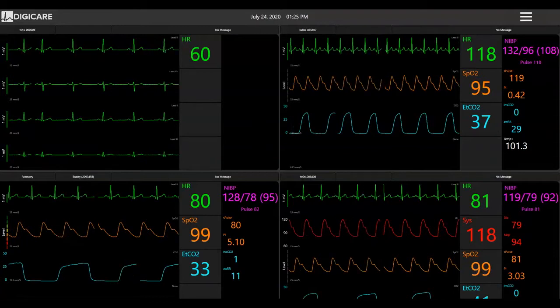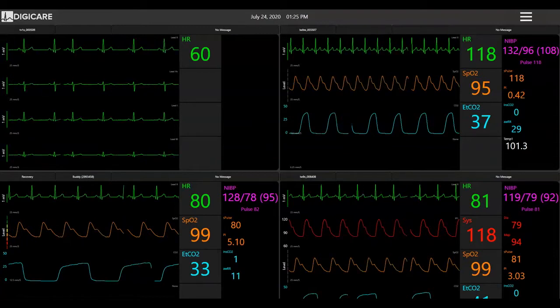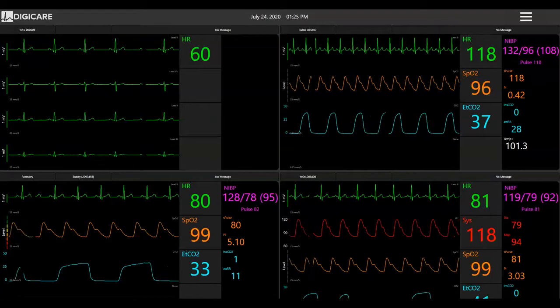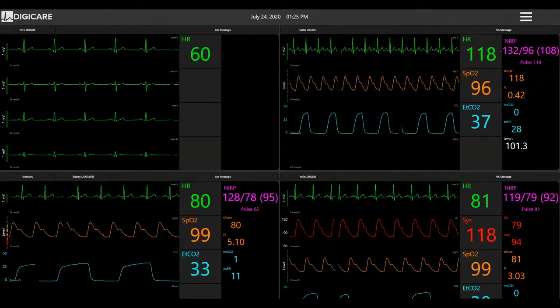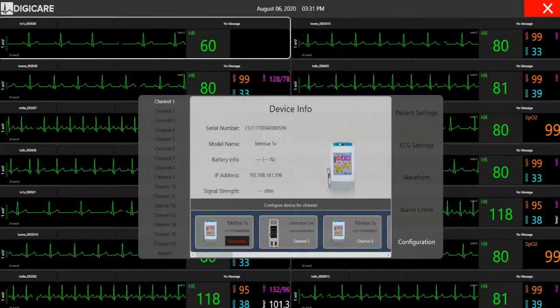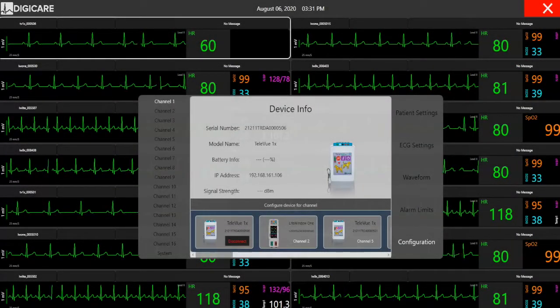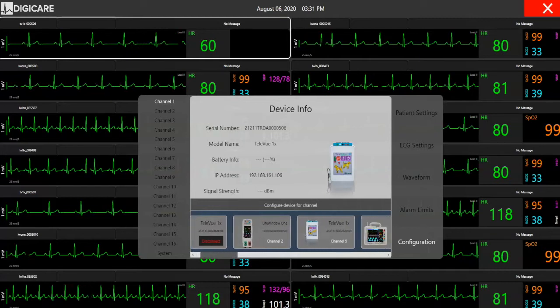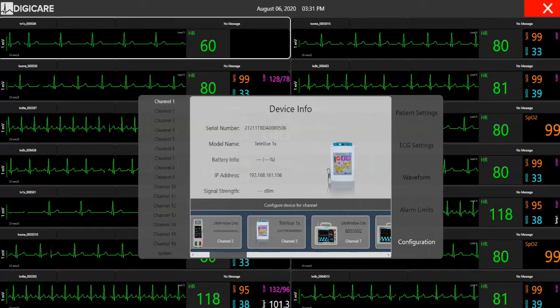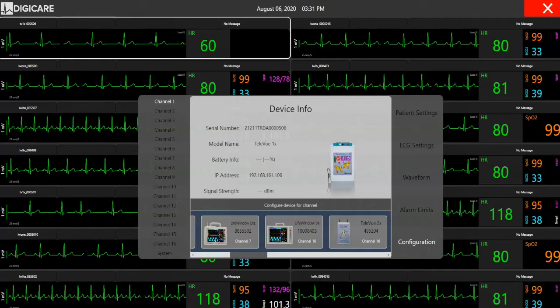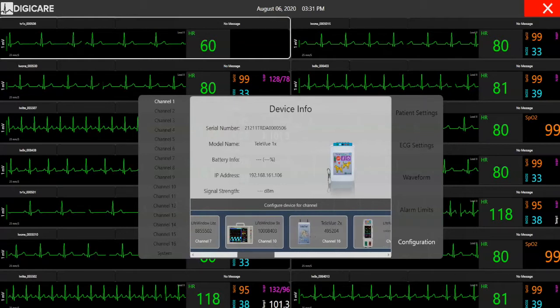The CentralView supports connection with DigiCare's TeleView transmitters and LifeWindow Series patient monitors. Through its touchscreen interface, users can easily modify the configuration of the system and select the desired devices for each specific channel.